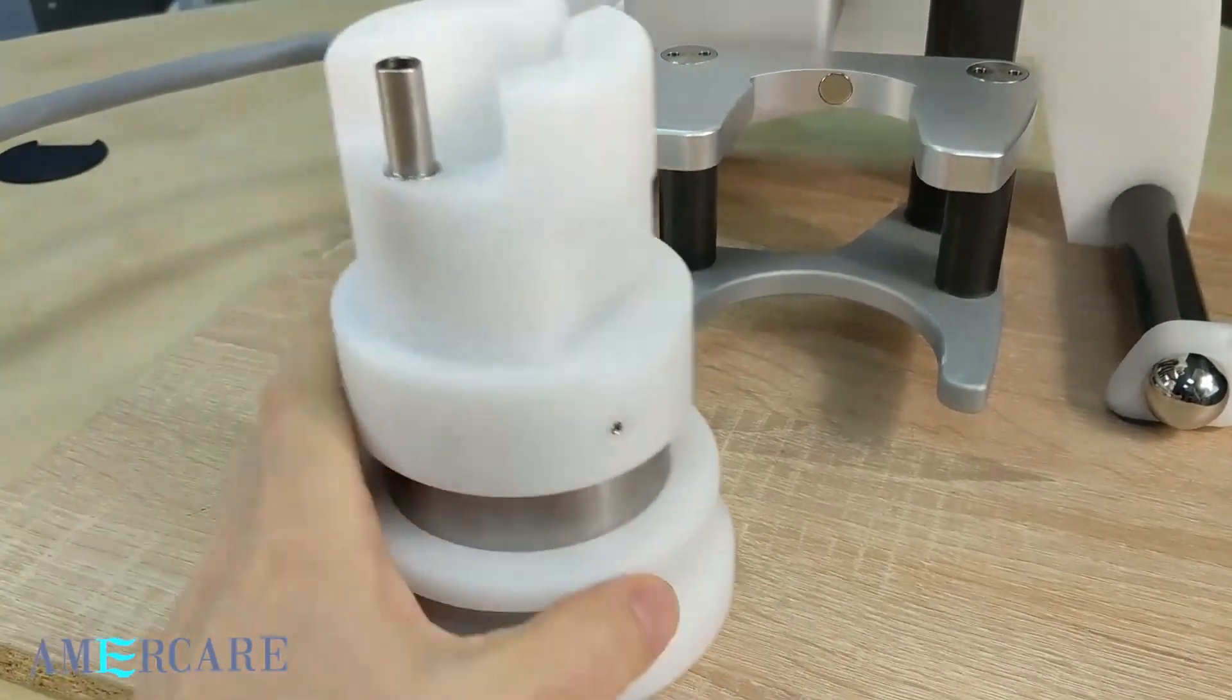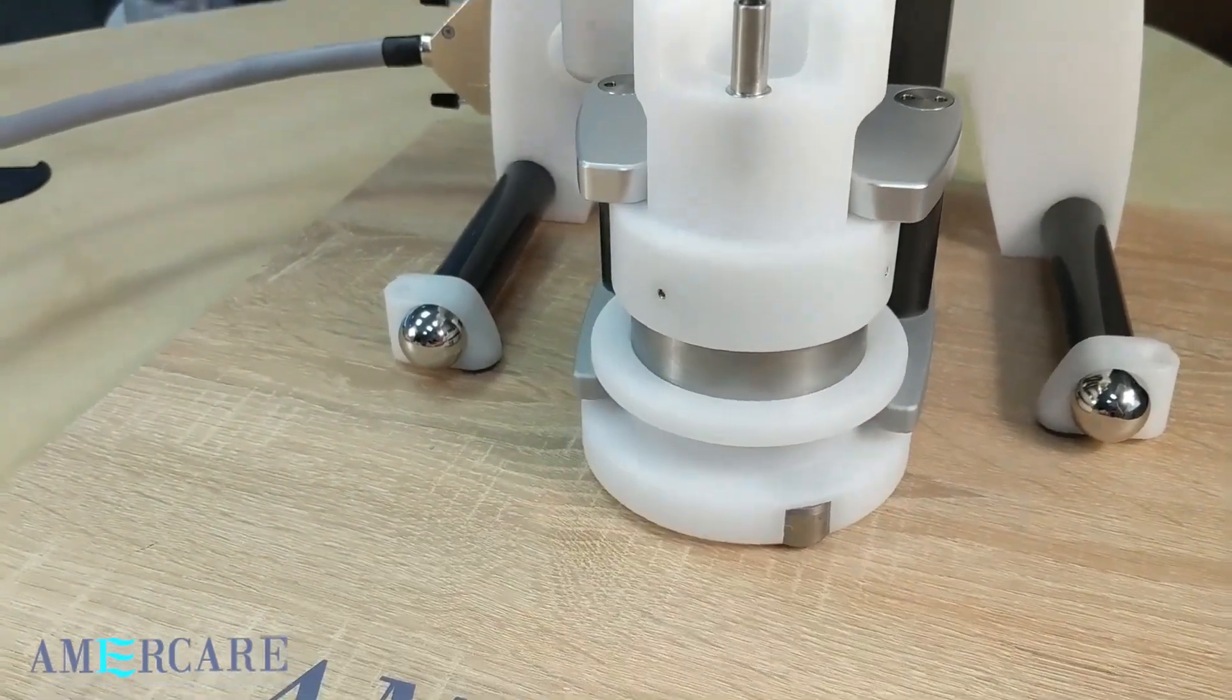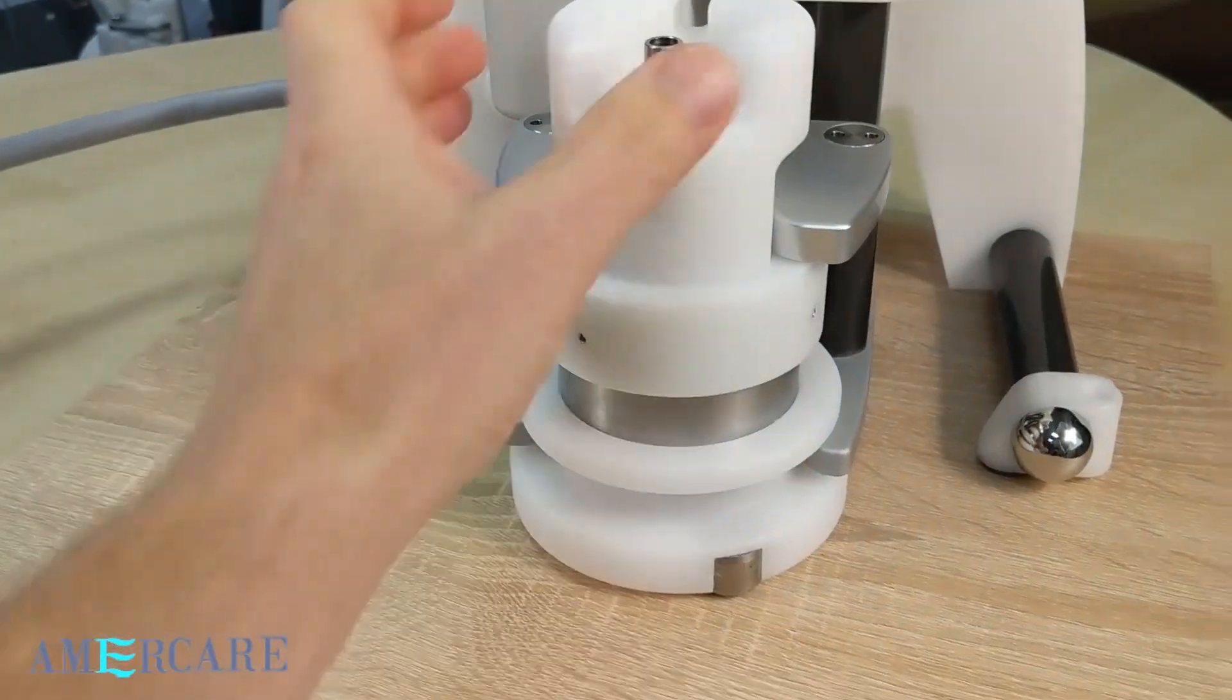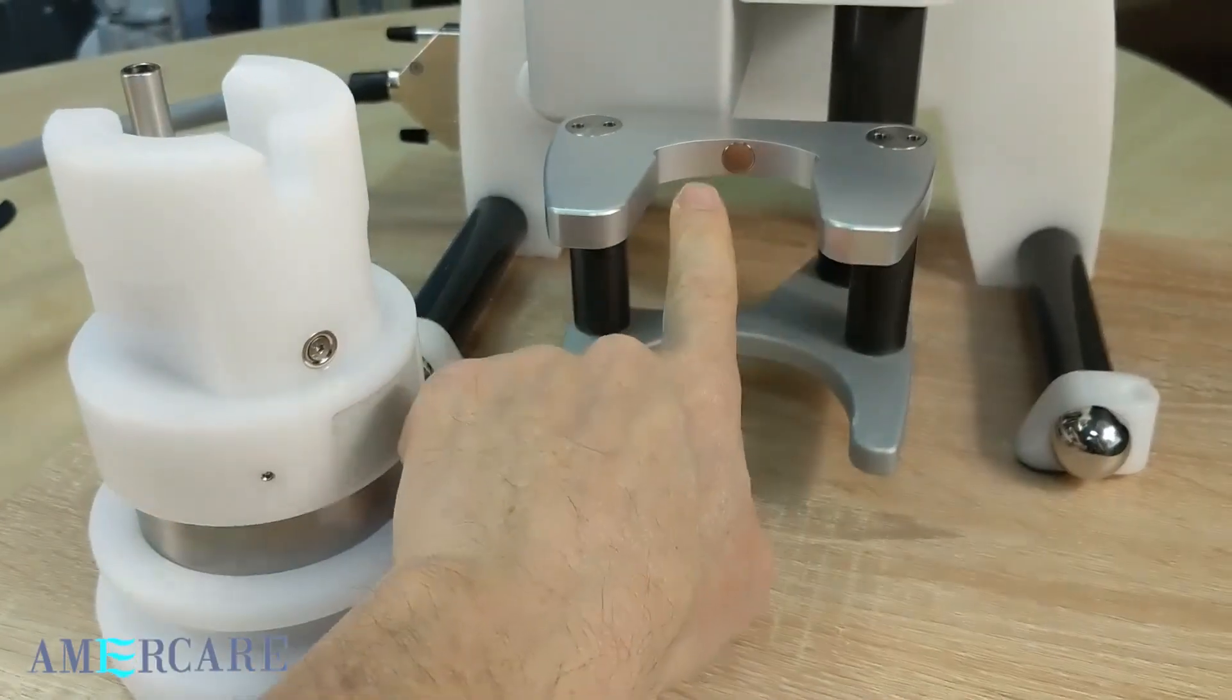So if correctly aligned, the vial shield should, with very little effort, load into the jaws. It is lightly held into position with two magnets, one on the vial shield and one on the jaws.